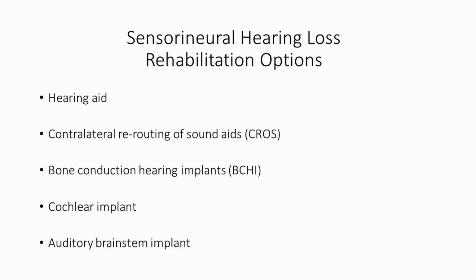And there's lots of options in terms of hearing rehabilitation. I'm not going to dwell too much on hearing aids and the second and third options there, just to touch on them briefly, but I'm going to focus mainly on cochlear implants and auditory brainstem implantation. So next slide, please.